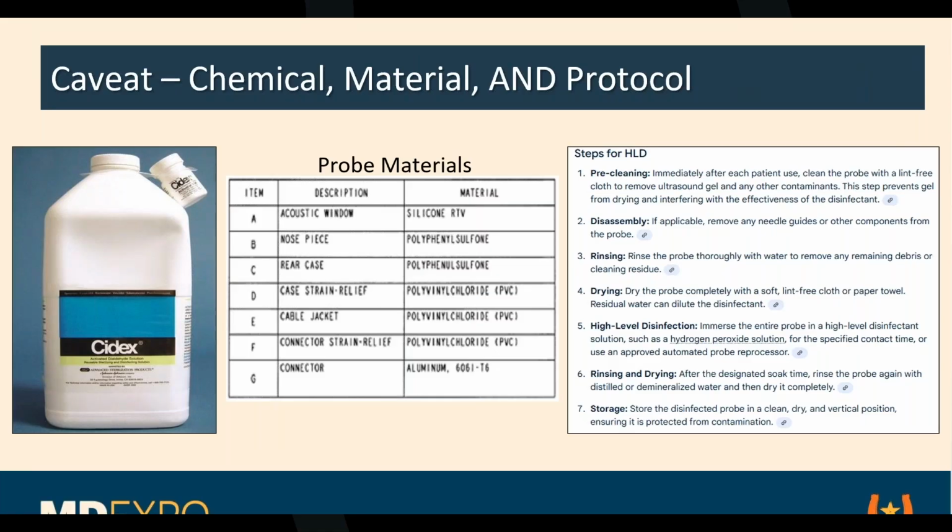And so they tell us what the materials are, but as a third-party service provider, we have to go in and do reverse engineering on all of these parts and materials and make sure the materials we are using match that, okay?